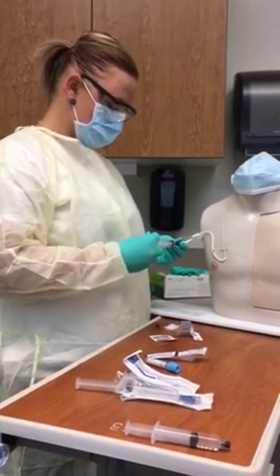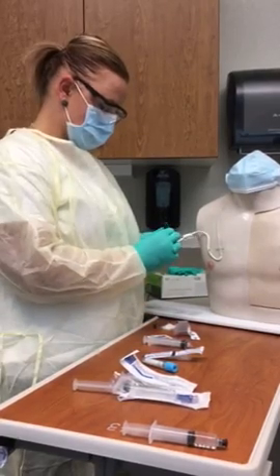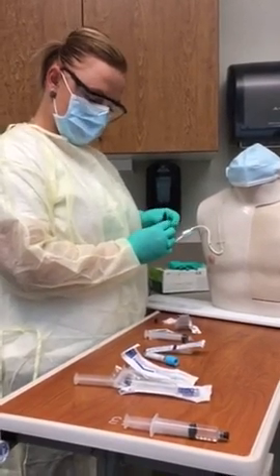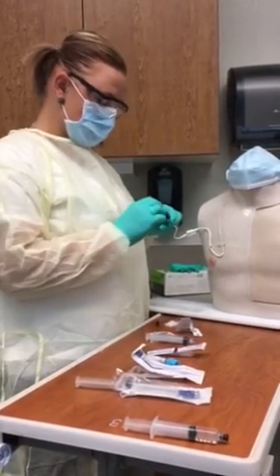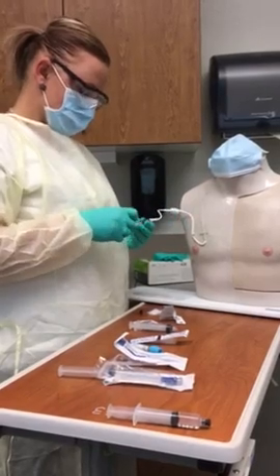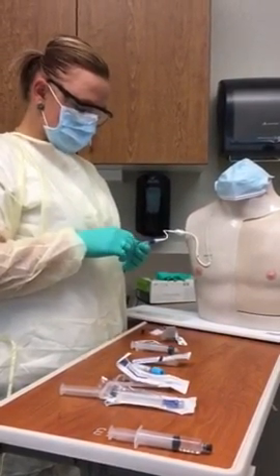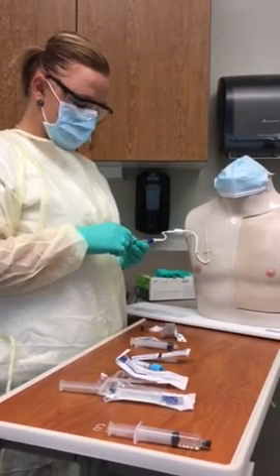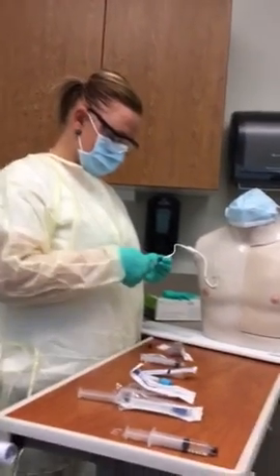Okay. Go ahead and take this off. Go ahead and clamp that. I'm now going to take my first 5 ml syringe, and I'm going to waste this first 5 ml of blood. You're going to waste my blood? Well, the first 5 ml is still going to be mixed with normal saline, and we just don't want that to alter your lab results at all. Oh, okay, that makes sense.